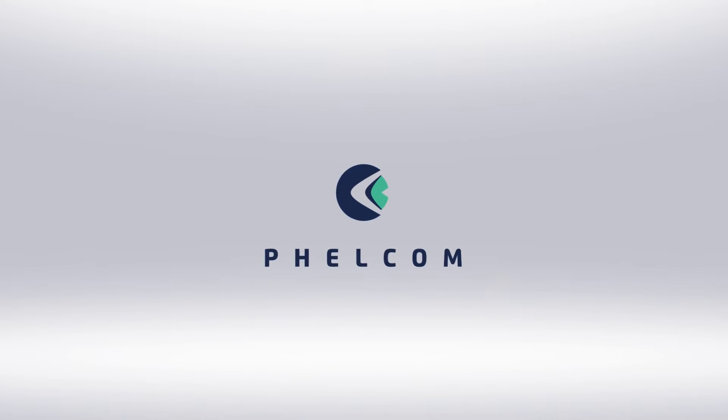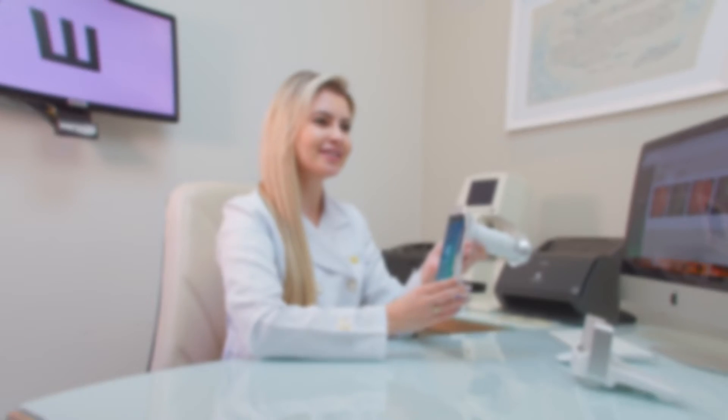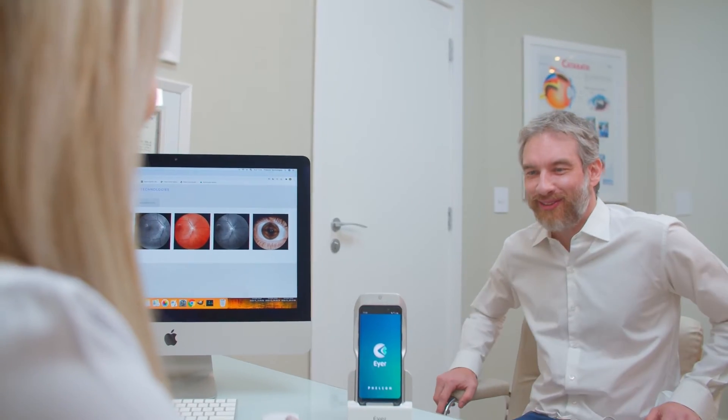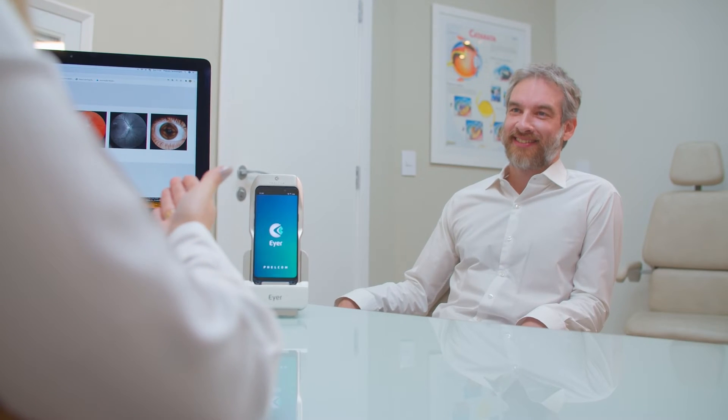Welcome to Eyer, your first smart medical device. Today, learn how to use it and capture amazing photos of the retina and anterior segment, winning your patients over and increasing the value of your consultations.